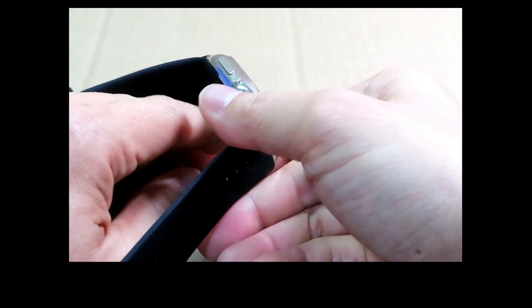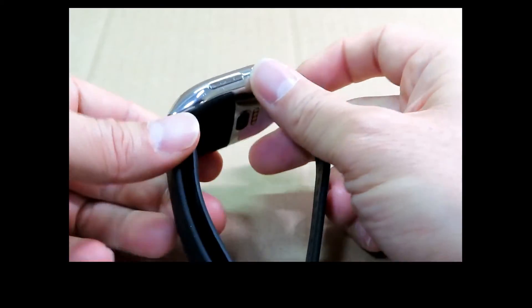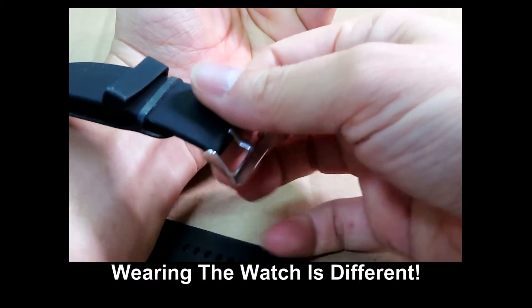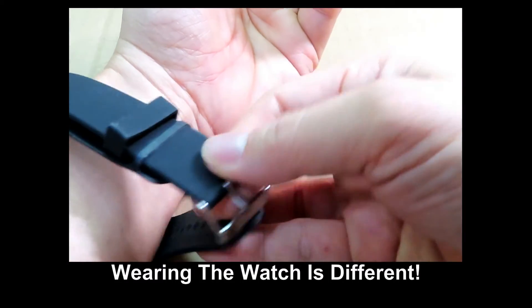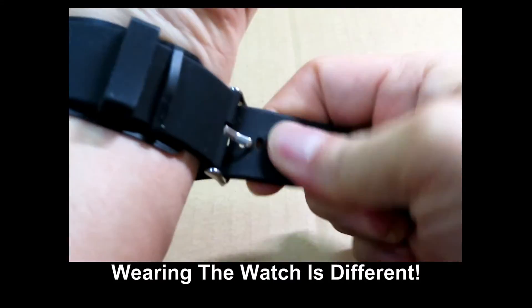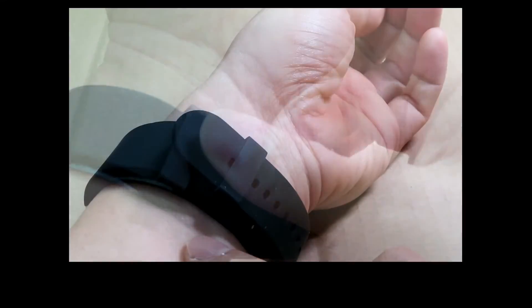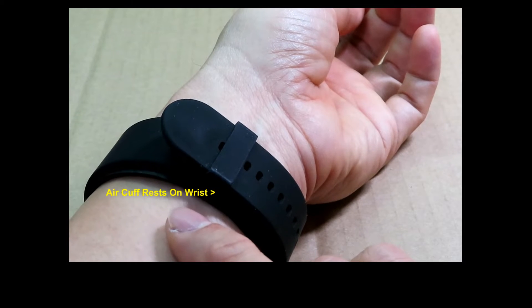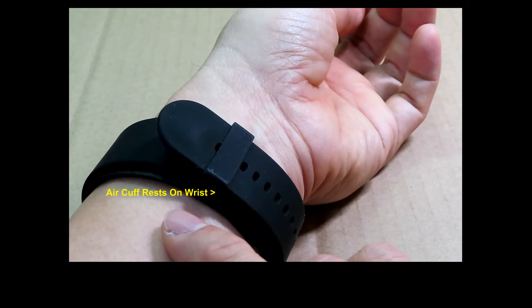One thing unique about this watch is the way you wear it. It is not worn the usual way. It is worn differently because of the air cuff that rests on your wrist for blood pressure taking.